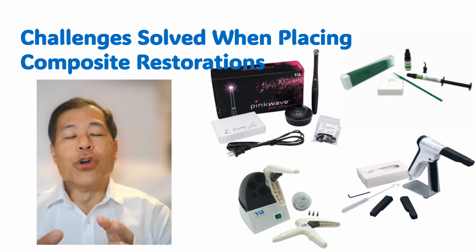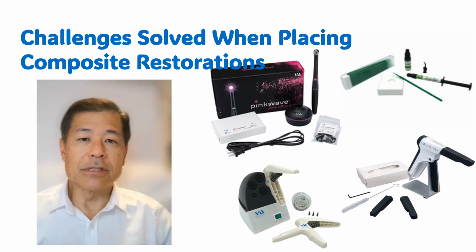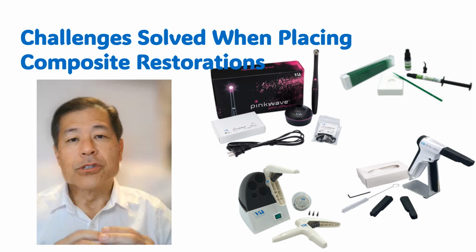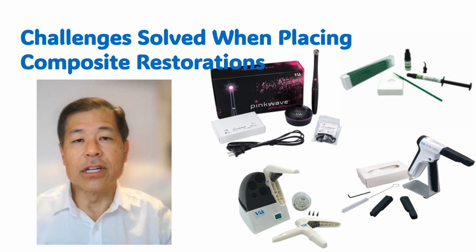And then if you don't place enough material the first time and you add a second layer to that first layer, and then you cure everything and you polish it up, you get the little white line between the seams where you can tell where the first layer was placed and then the second layer. So doing a large surface area type composite has its challenges.